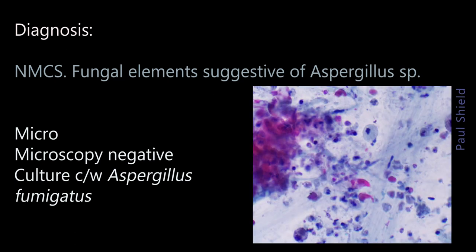One thing to keep in mind is that when you have an aspergilloma present in a cavitating lesion, there can be a large amount of necrotic debris, some of which can look eosinophilic, orangeophilic, and degenerate. And there are cases recorded of this being misdiagnosed as invasive squamous cell carcinoma.